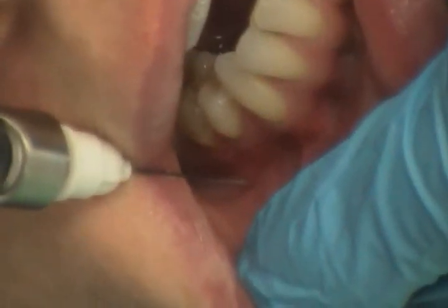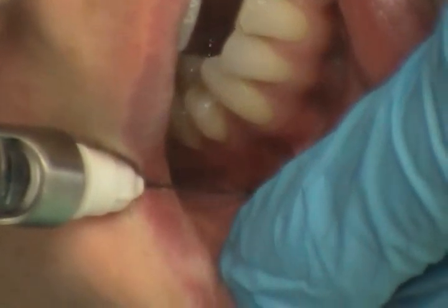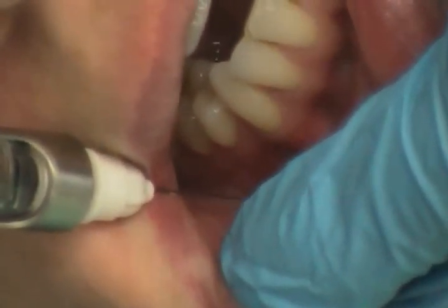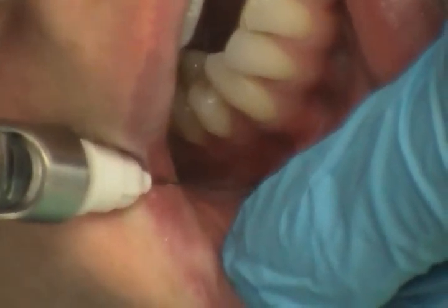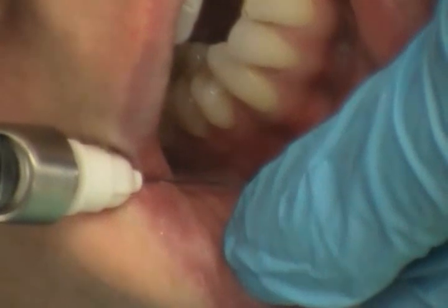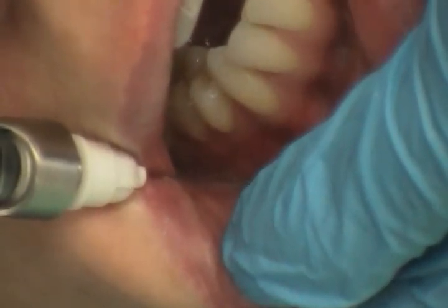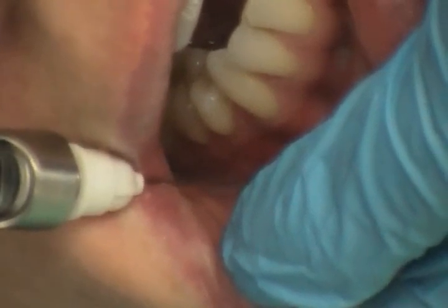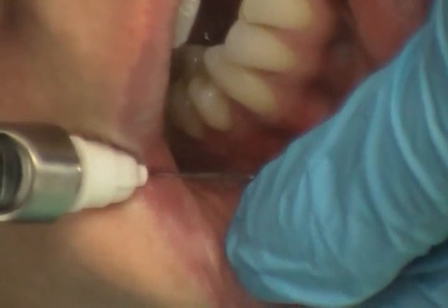The depth of insertion is 5 to 6 millimeters. Osseous contact: there is none. Advance the needle slowly until the level of the mental foramen is reached. There is no need to enter the mental foramen for the incisive block to be successful. Aspiration potential is 5.7%. Aspiration negative. The amount of solution is 0.6 milliliters over 20 to 30 seconds.